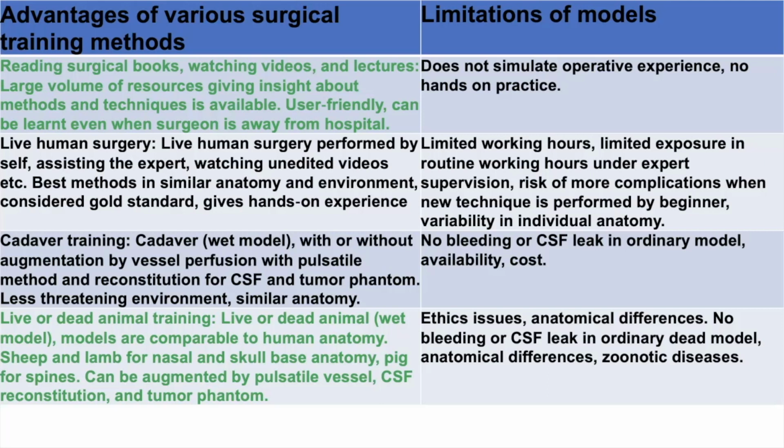It is also in the less threatening environment, and the other advantage is that you have similar anatomy. The limitations are there is no bleeding or CSF leak in the ordinary model. Availability is also a concern and it may be costly.